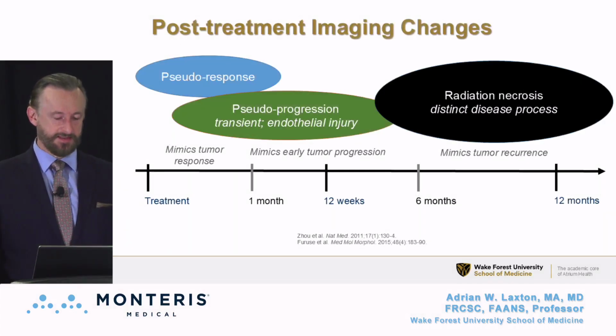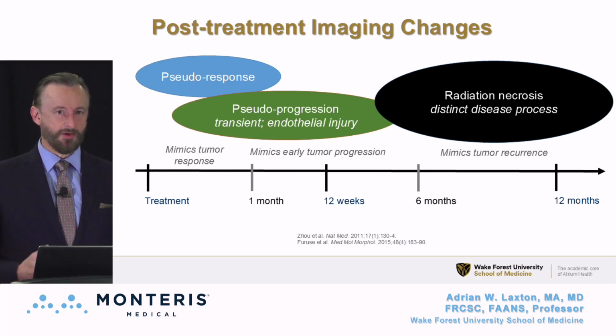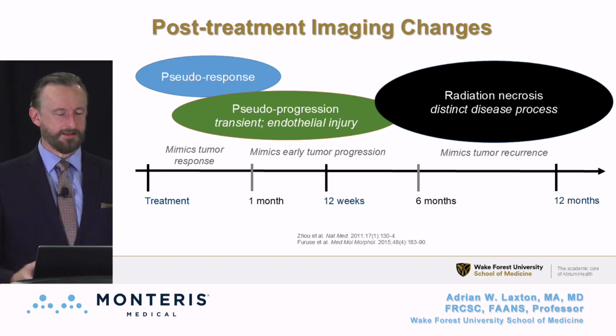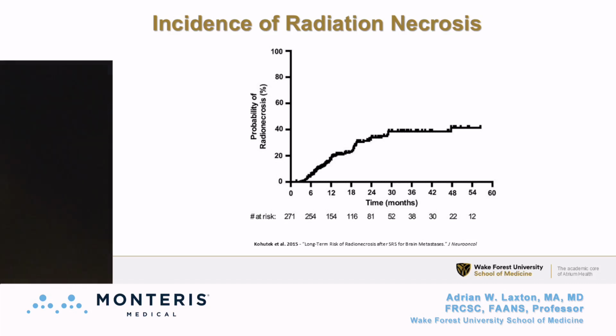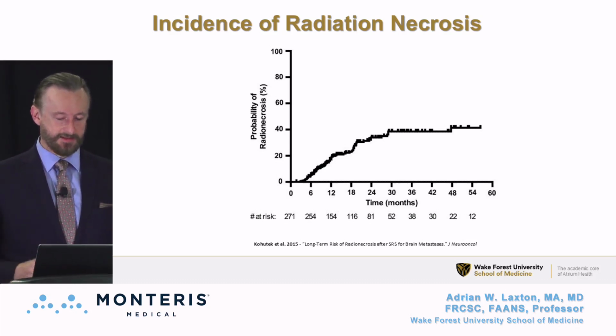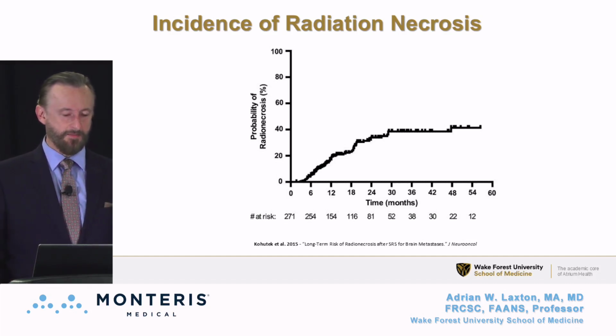And the changes that we see can be challenging for us to know what to make of them. So perhaps early edematous change that we're not so concerned about, and that we know is going to resolve in time. But at 6 months, if we start seeing something that had looked like it was getting smaller and now it's rim enhancing and looking larger, is that radiation necrosis? Is that tumor progression? This is a clinical situation we find ourselves in more and more frequently. In the setting of radiation necrosis, the further out from our radiosurgical treatment, the higher the likelihood that we will be confronting it, plateauing around 30 months or so. So for a good 2 years for these patients, we're looking at, what is the imaging telling us right now?